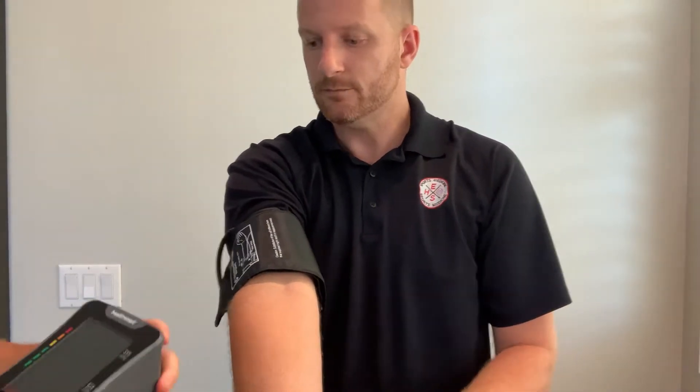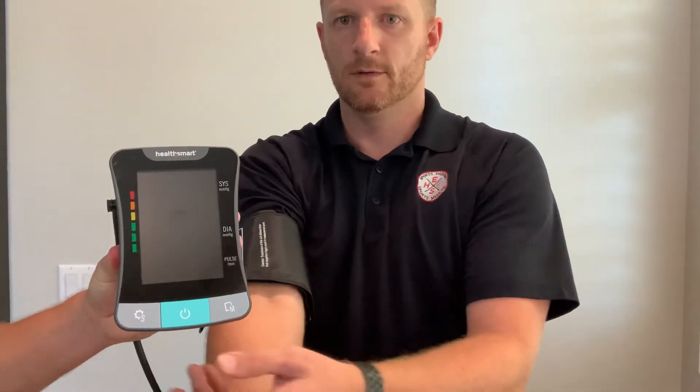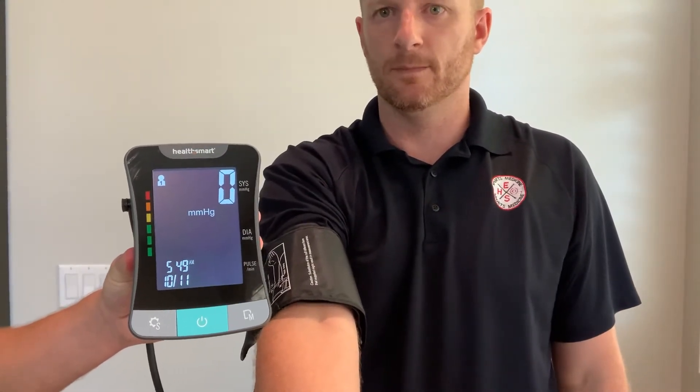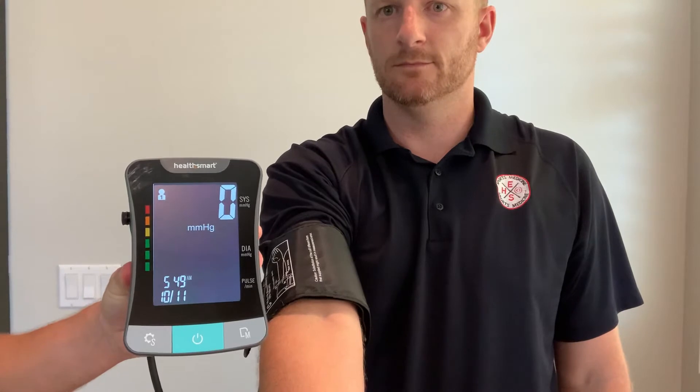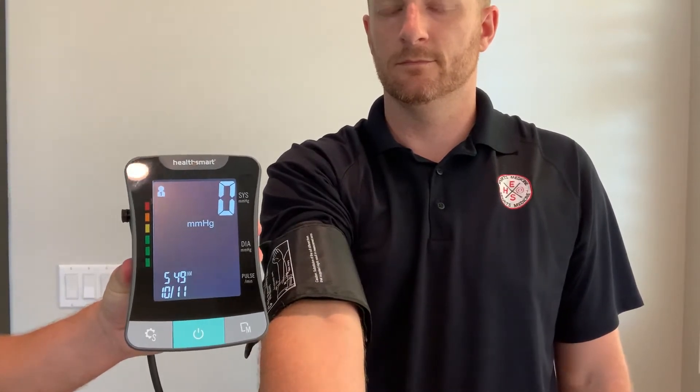We're going to push the blue power button and let it run its course and take my blood pressure. Make sure your arm is at the same level as your heart. Do not move and keep quiet. Now if you are ready, let's begin.